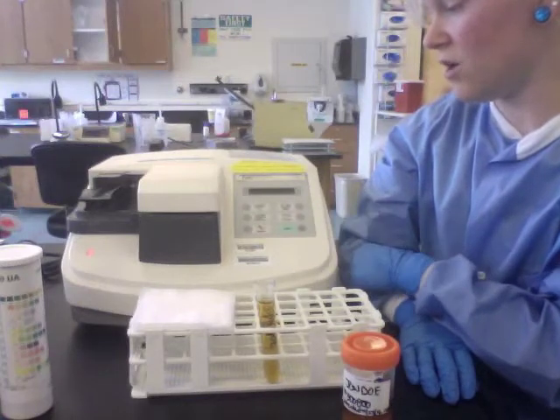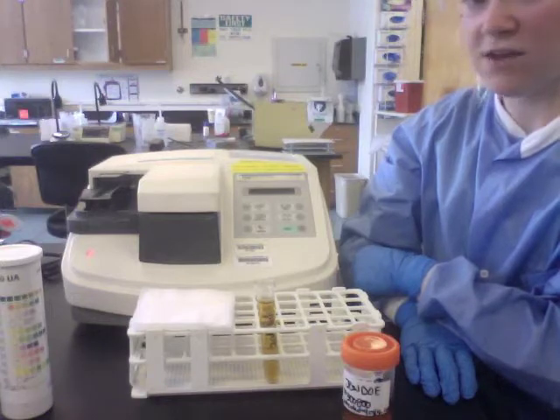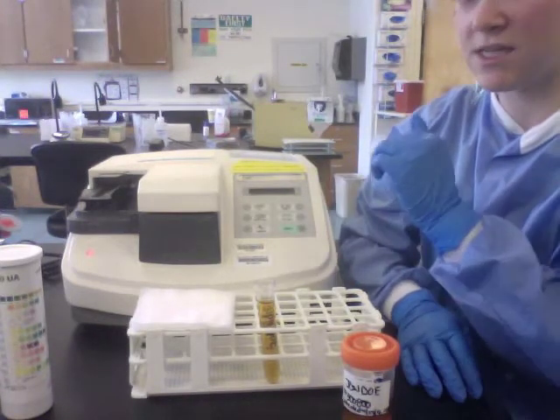So first I'm going to turn it on. It does a self-check, and since it doesn't say I have to calibrate it, it says ready.